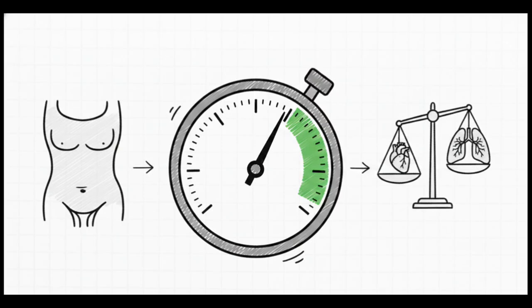Got it? The target is firmly set right at 12 to 15 millimeters of mercury. This specific range is exactly what provides the optimal balance. It gives you adequate working space while minimizing all those adverse cardiovascular and respiratory physiologic effects we just discussed.